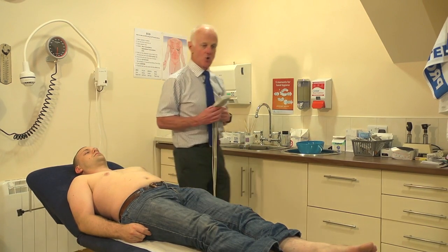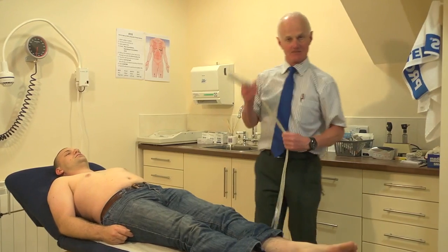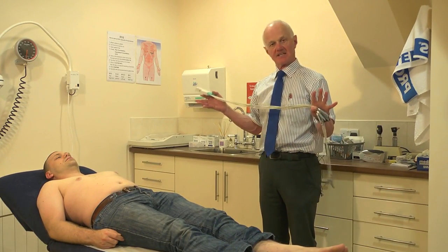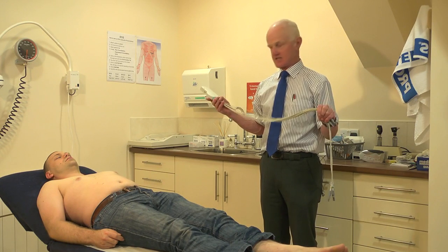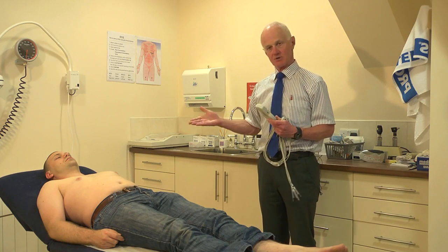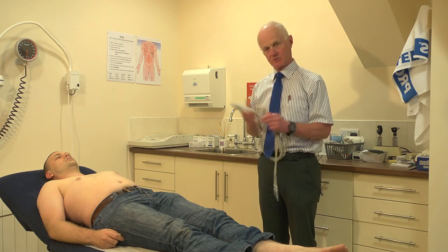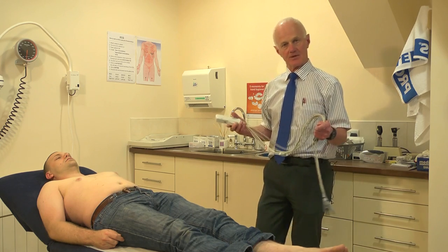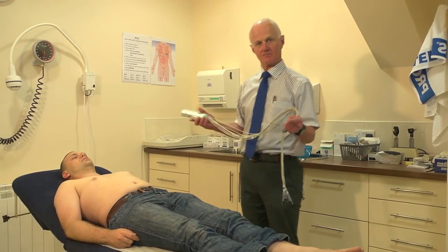It's really important that everybody knows and has easy access to both the machine and instructions on how to use it. From then on it's actually very easy to take an ECG with this device. With Martin's permission I'm now going to hook him up to the device, then go to the PC and click a button, and the rest will happen automatically as this is a Bluetooth device.